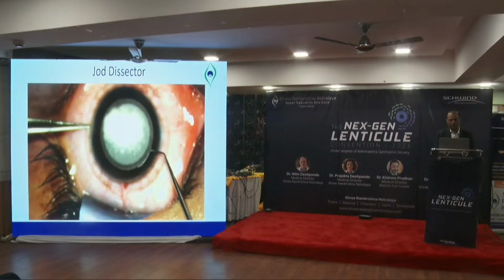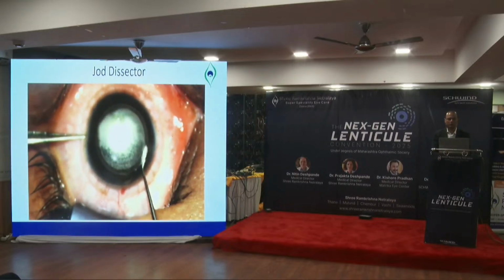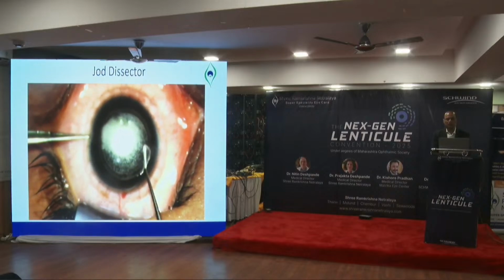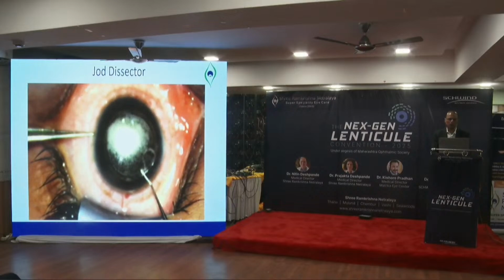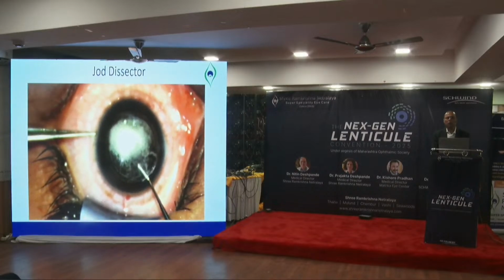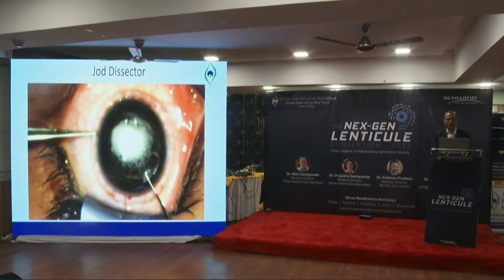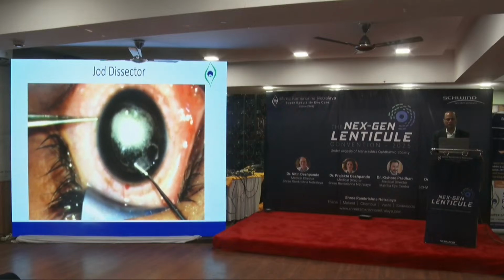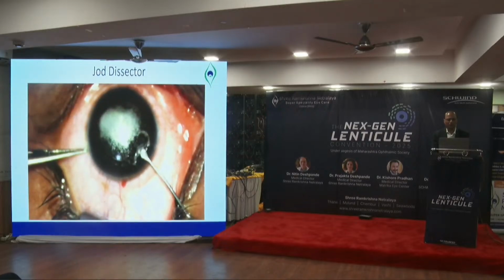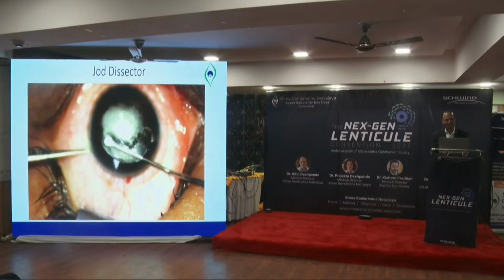Then another posterior entry case where I've used a different, interesting and good instrument called the Jod dissector. It's by Dr. Jod Mehta from Singapore National Eye Center. He's devised this instrument with Katena. So you have different instruments in your armamentarium which you can utilize every now and then whenever there is such a situation. You can see I'm dissecting, everything is going smoothly, and I feel I am dissecting the anterior plane.